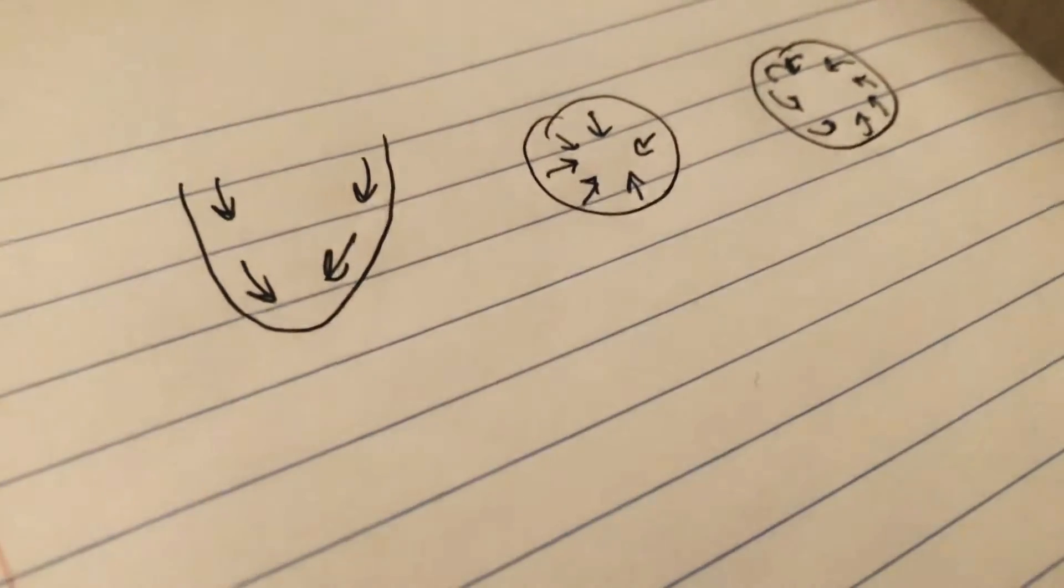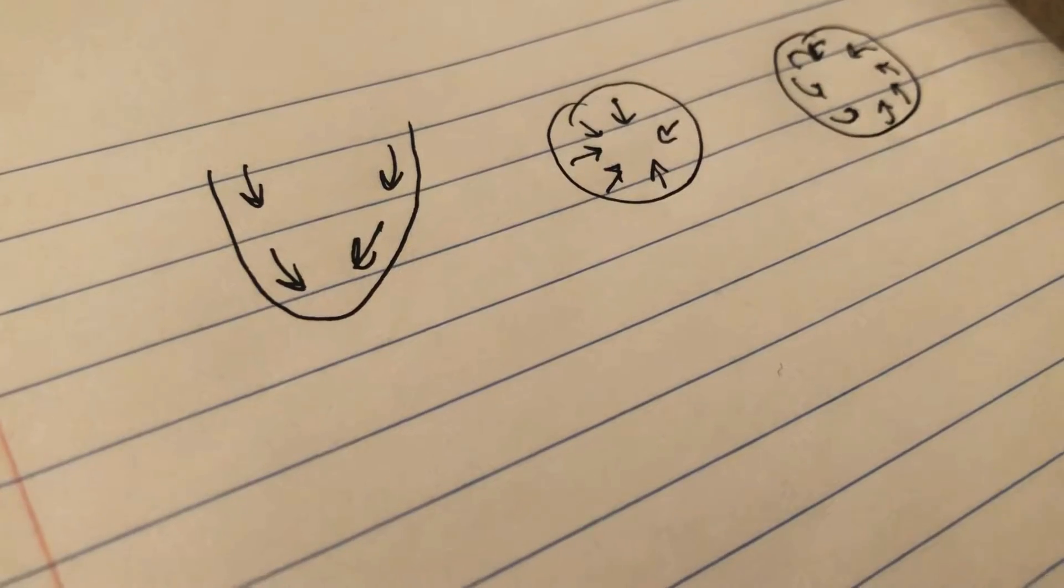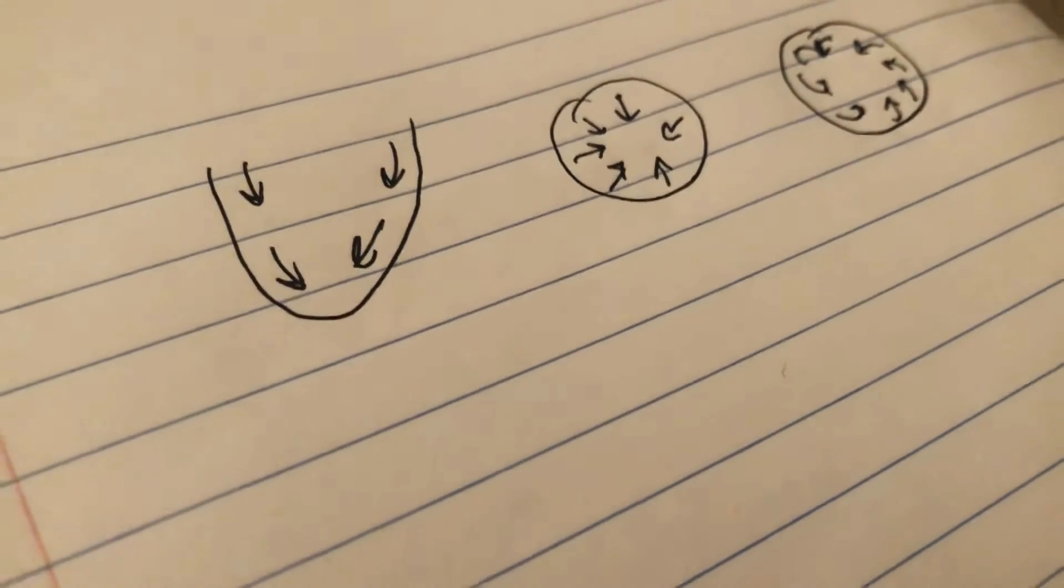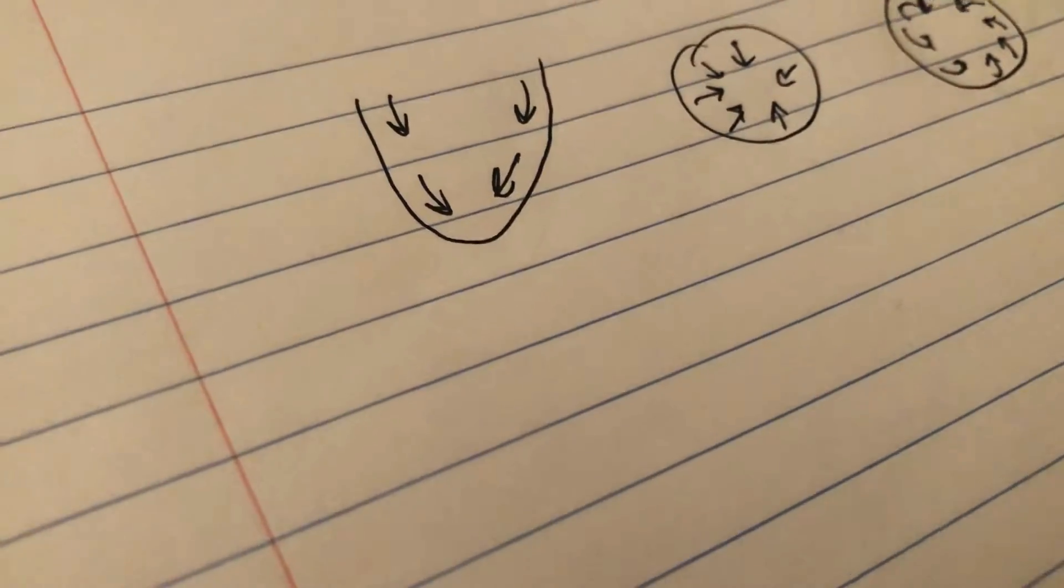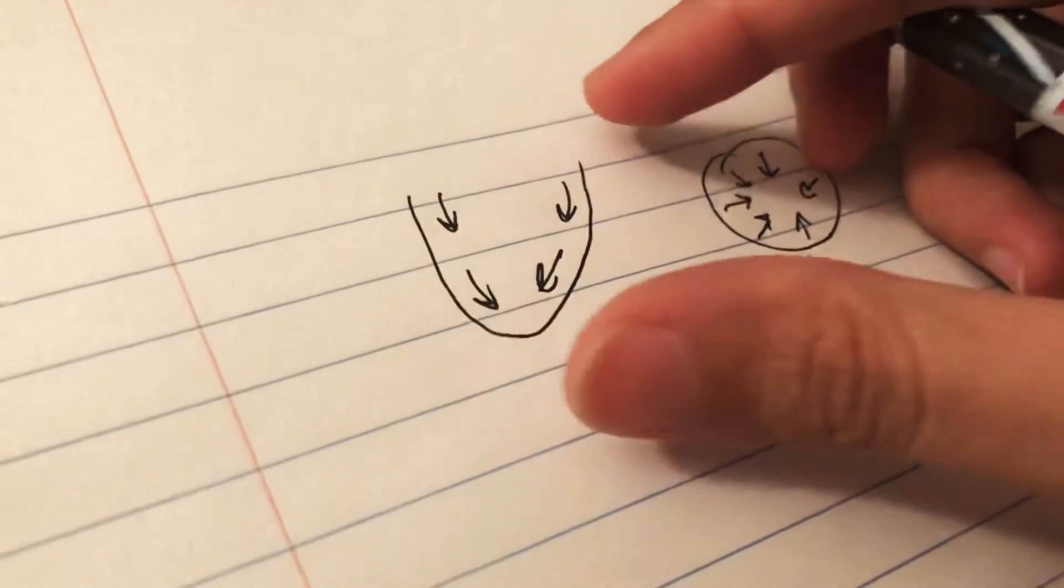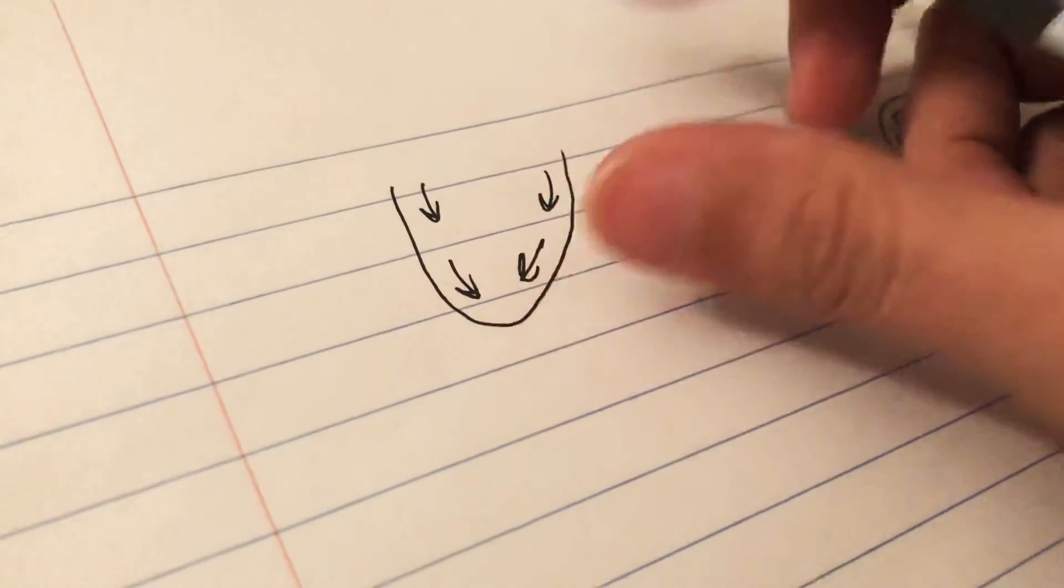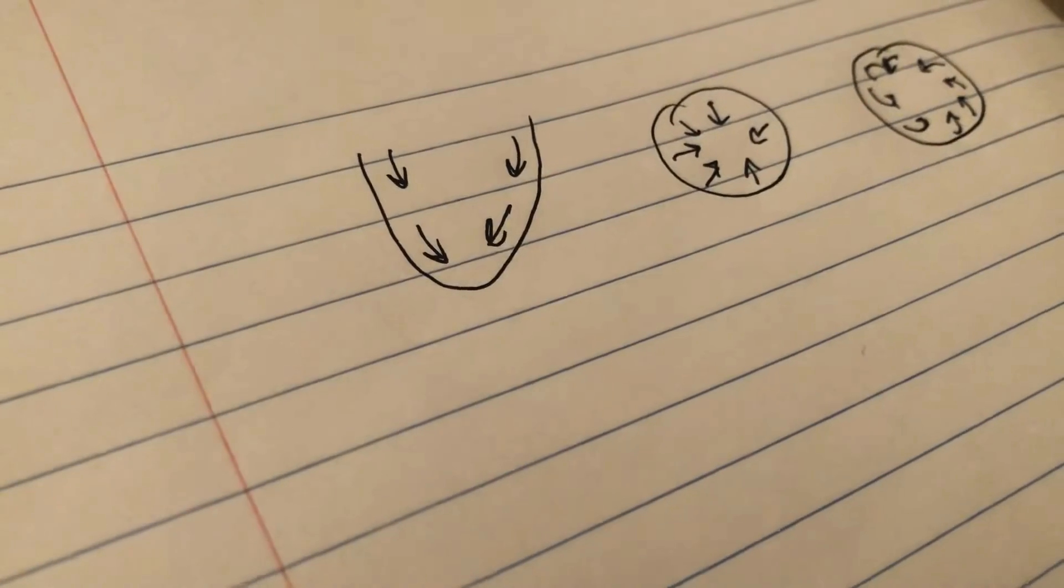For the LV systolic function, we look at the ejection fraction of the heart, but for the RV systolic function, we look at TAPSE. The way we measure TAPSE is actually a measure of the longitudinal shortening of the right ventricular fibers.